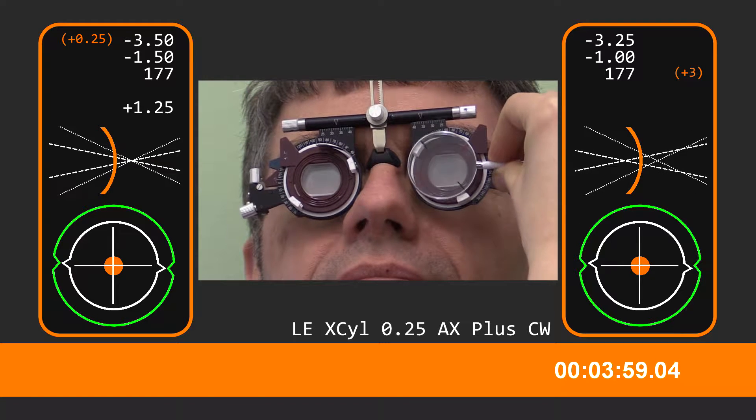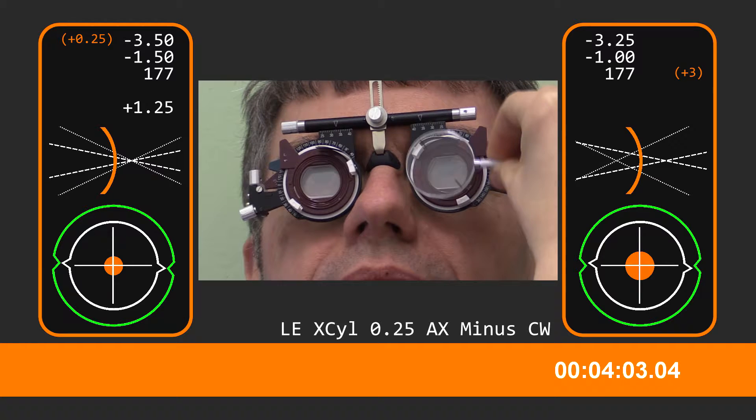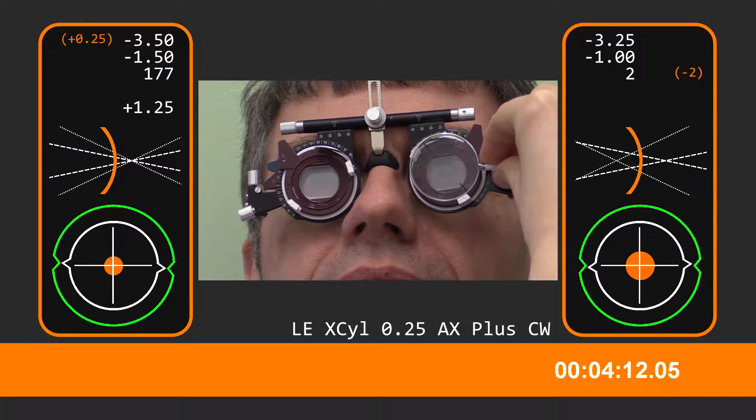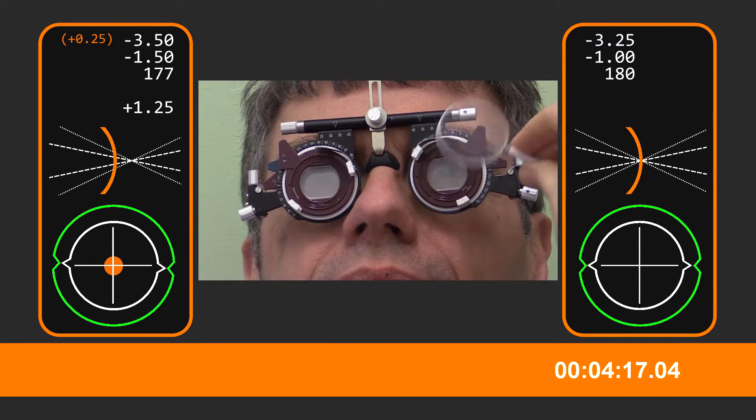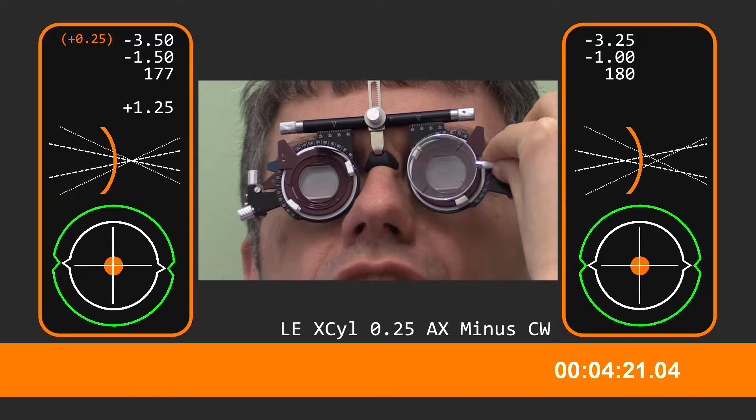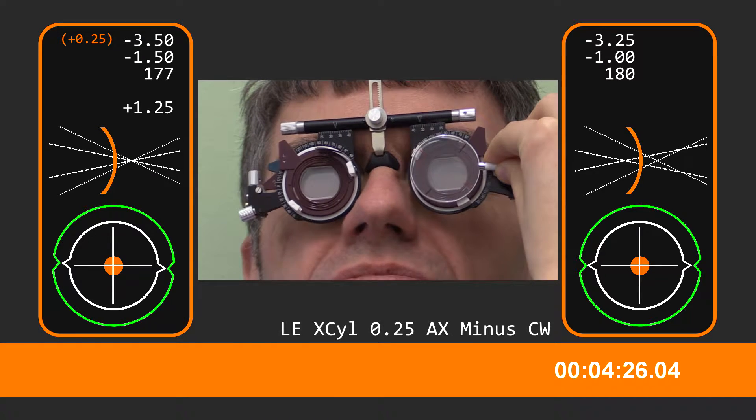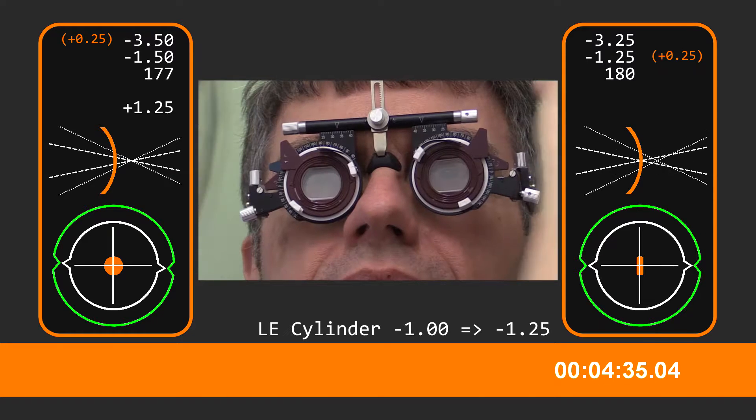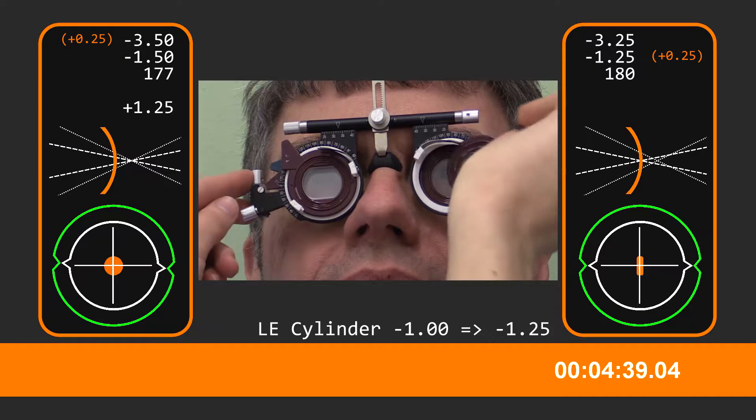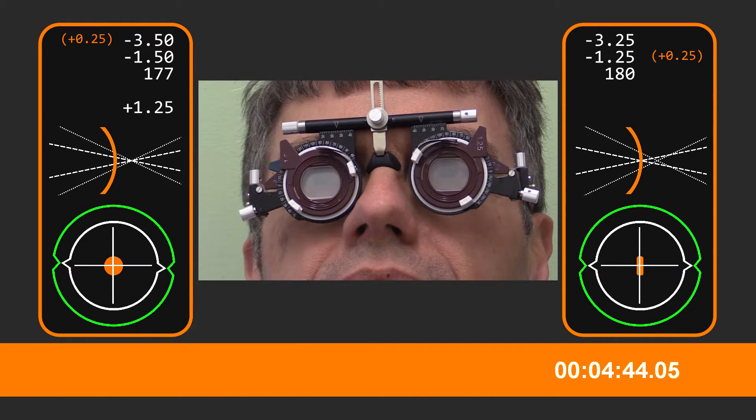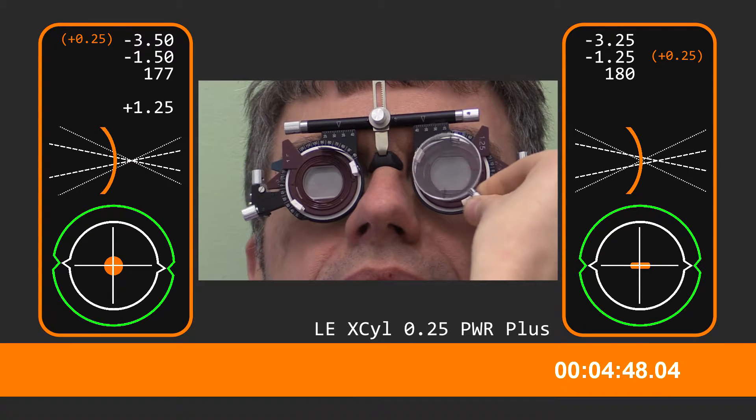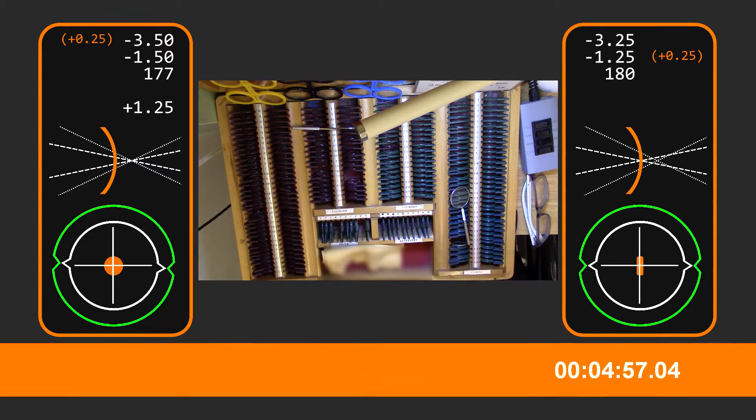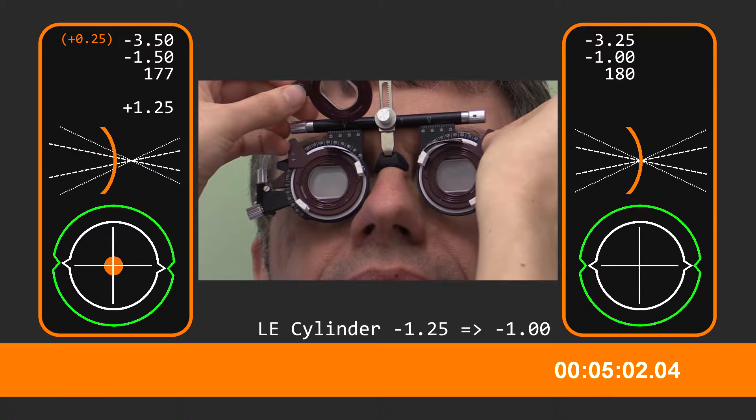Okay, and with or without, no real difference there. Looking at the white background and the circles on it, are those circles rounder and clearer with one or two or about the same? I'm not sure, show it again. So that's one and that's two. Maybe one or two or about the same. Two sliding in. One or two or about the same? Show me again. That's one and that's two. Probably nothing in it now I reckon. And with that was three. Four, four I'm four. Four. Three, four, four.